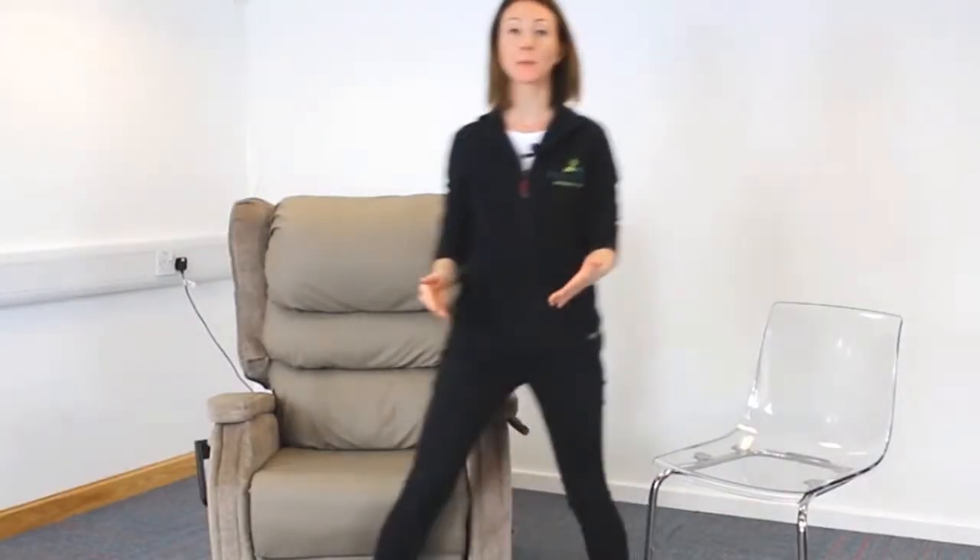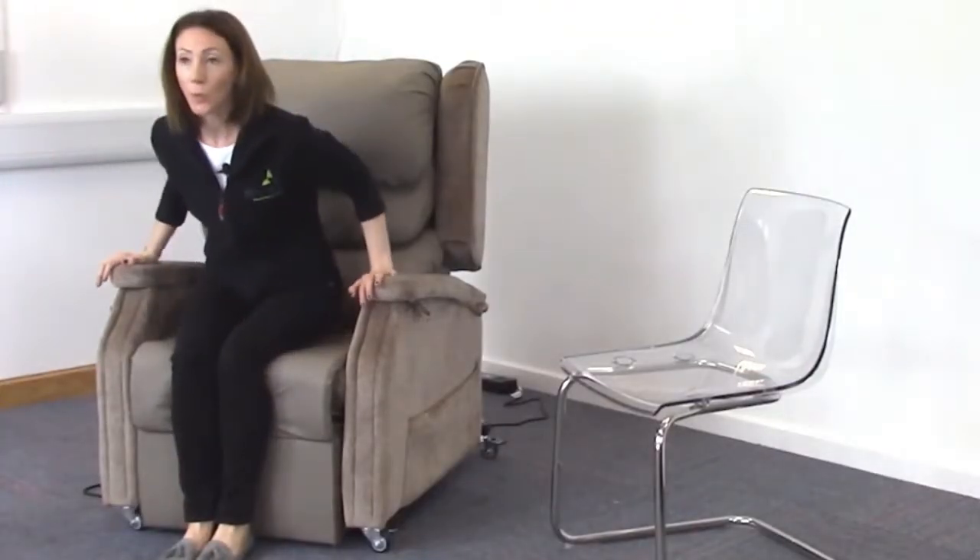Ideally we would like a person to be able to sit with their feet firmly on the ground and bring their bottom all the way back so that their back is well supported at the back of the chair. This gives them a really good upright positioning and allows them to sit comfortably without having to shuffle back, which increases risk of shear and friction, and without having to prop themselves on the seat and flop back, which puts a huge amount of pressure on the sacrum and also risks contractures and discomfort.